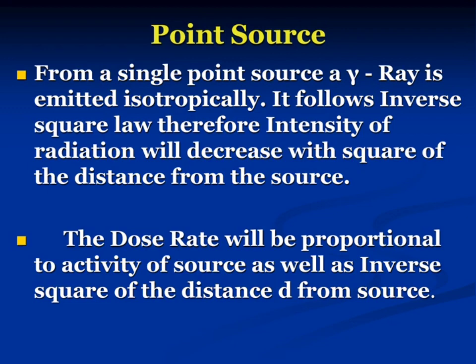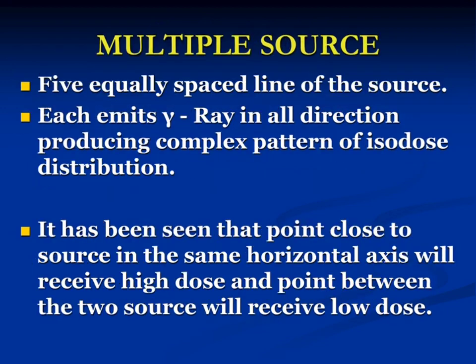Then again the iridium is currently widely used because of its high specific activity, meaning the specific activity per gram is very high, and a fine wire is available, you can see this 0.8 millimeter diameter. After the source encapsulation the diameter goes up to only 1.1 millimeter, so it is very suitable for transfer of a source through the catheter.